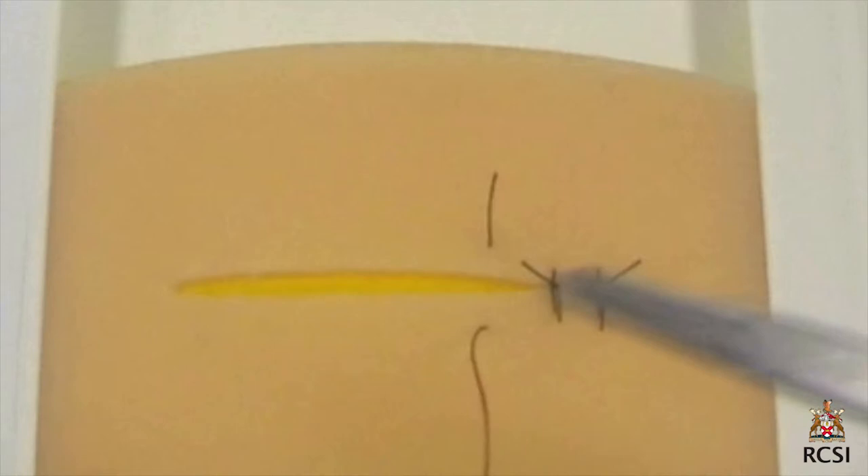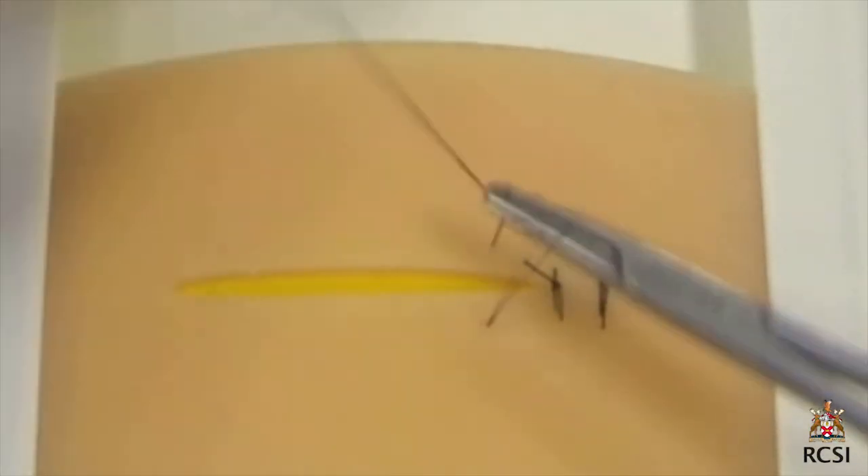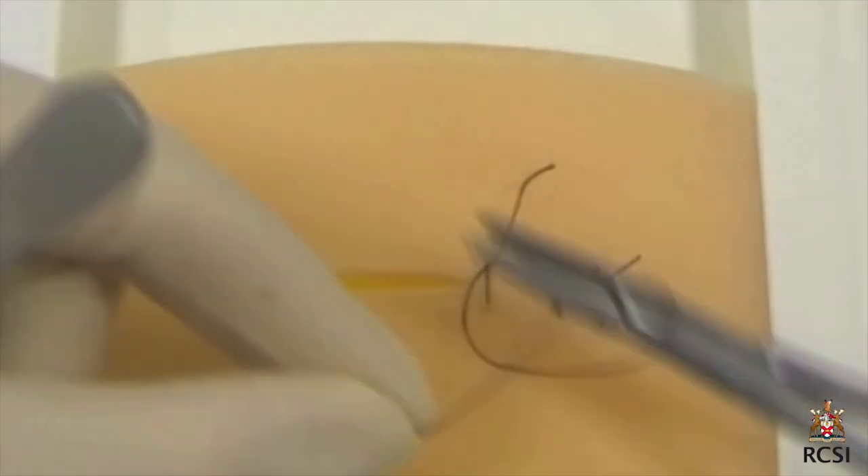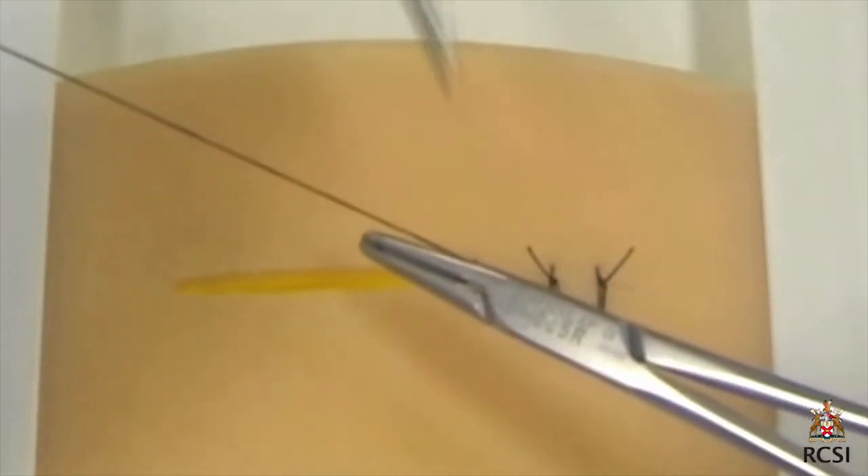You will see that the needle rotates through the wound and is not pushed in a straight manner. When performing each of the throws for the reef knot, the needle holder is always inserted inside the U shape made by the long end and short end of the suture.